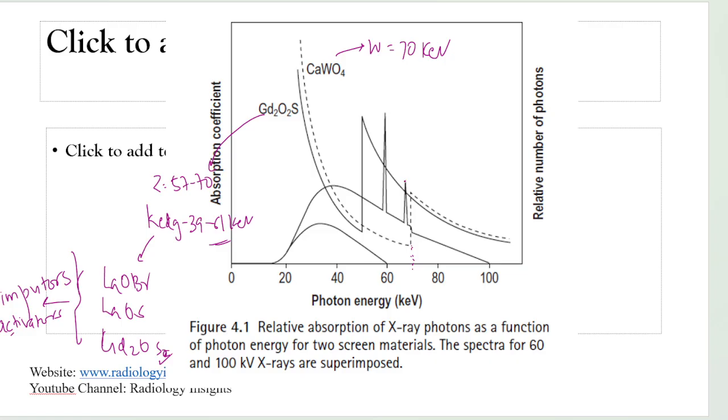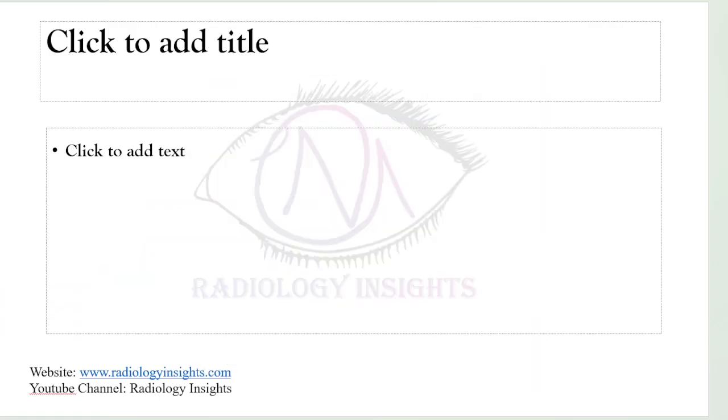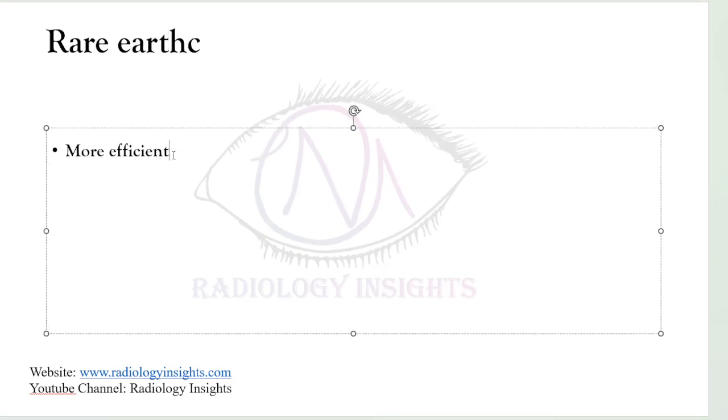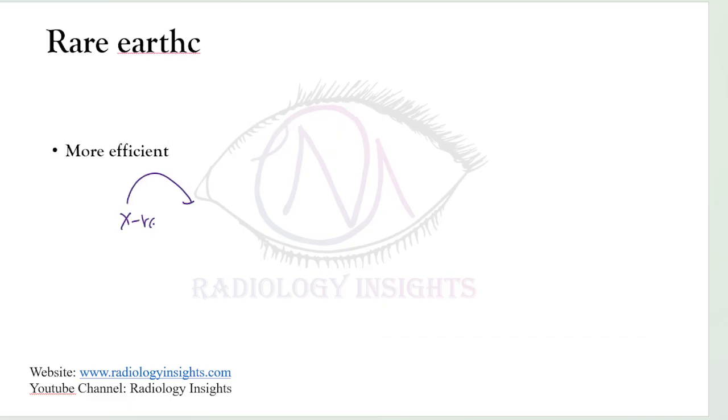Next, some important points about the rare earth elements. They are not chosen just on the atomic number; they are more efficient than calcium tungstate in converting the absorbed X-rays into light.